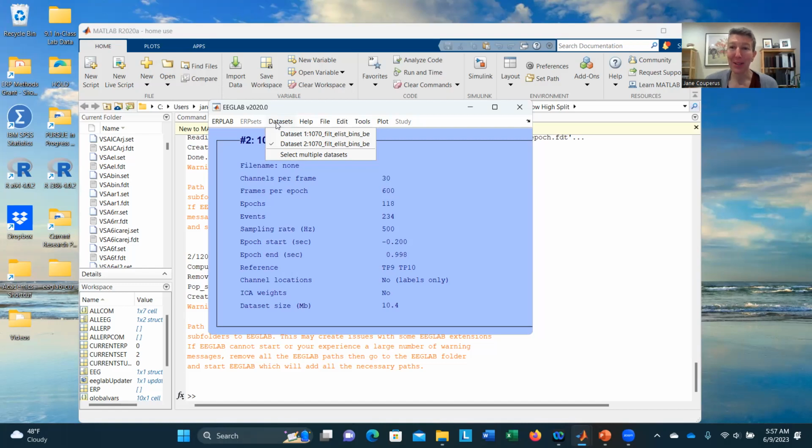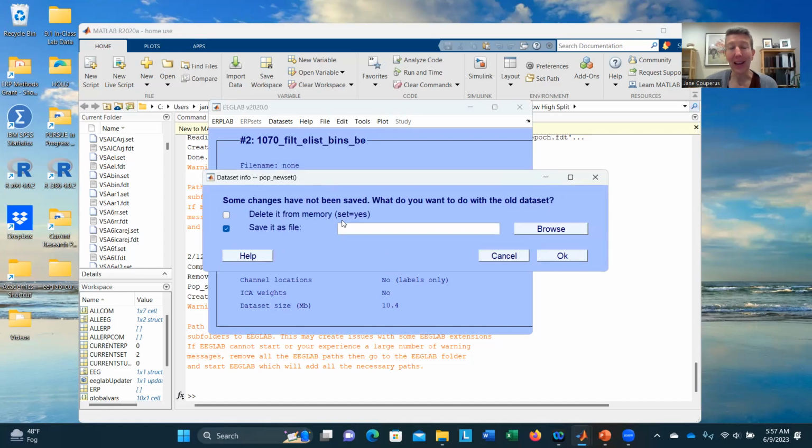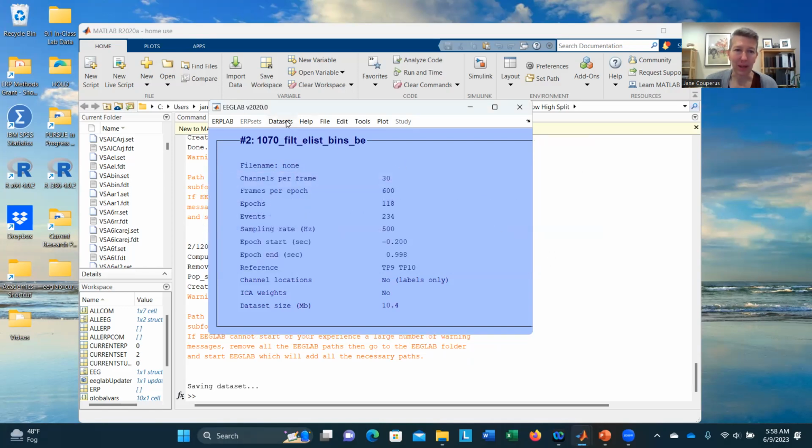But now I want to do this instead. I want to do this as an automated process. So I'm going to go back one step to my last file, and it's going to ask me to save my last file name because I've just changed what I was doing. And so I'm just going to save it with the name of the last one I did. And I might even say, you know what, this was my first time I artifact it. So I'm just going to give it that artifact 1. So if that pulls up, that I know what I did.